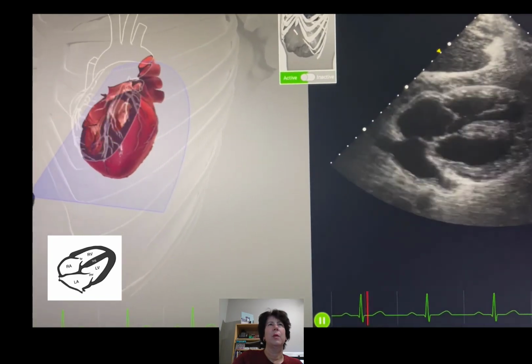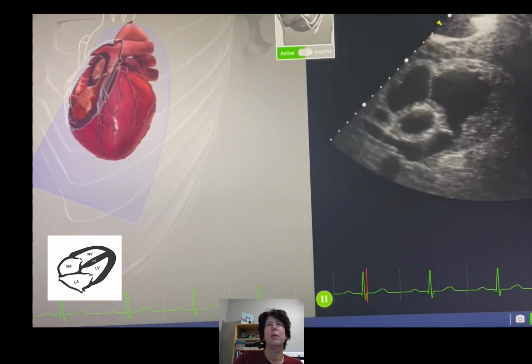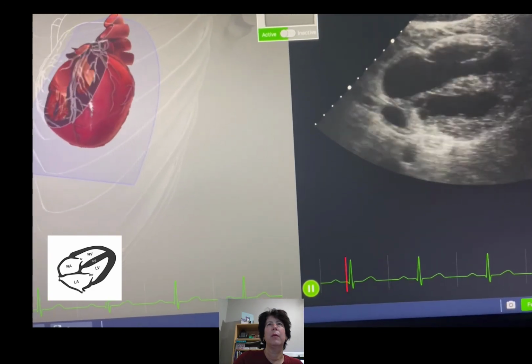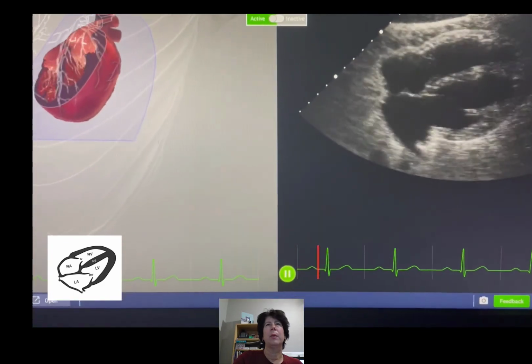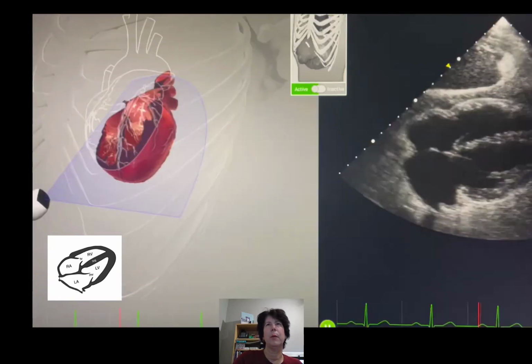Here we start our subcostal scan, and as we said, we're not always at the right depth. Sometimes we're too shallow. Here's the RV, a very shallow structure. Then we see the aortic valve next up. As we dip our probe down, we get this nice subcostal image. So RV shallow, then aortic valve. If you're still seeing the aortic valve, get that probe pointing handle up, the image pointing deeper.